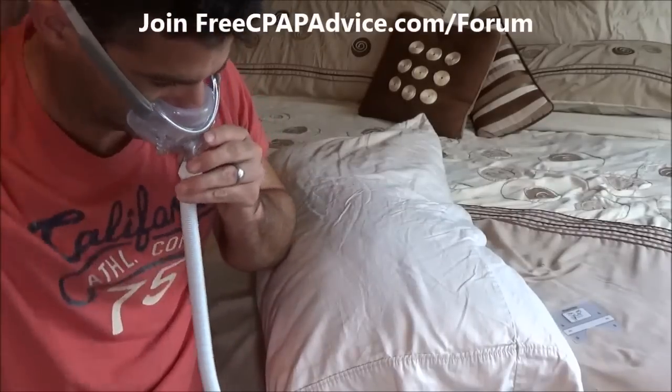Let's go ahead and try this on and sleep with it a little bit. You know what? Right now it's at 6. That's not enough. I'm going to go ahead and put it on something a little more substantial, like, let's go 12. I like 12.